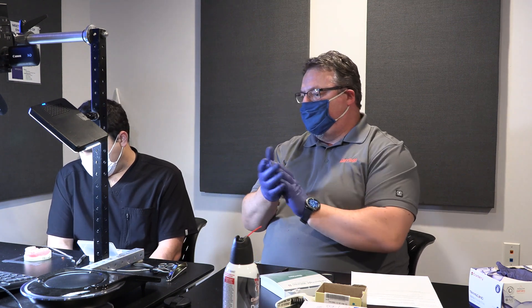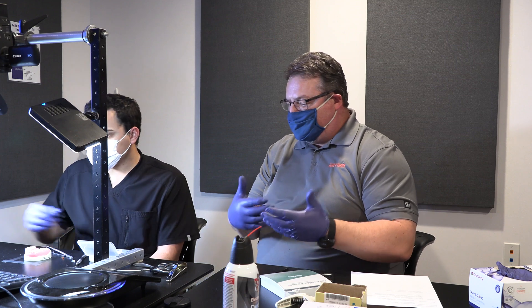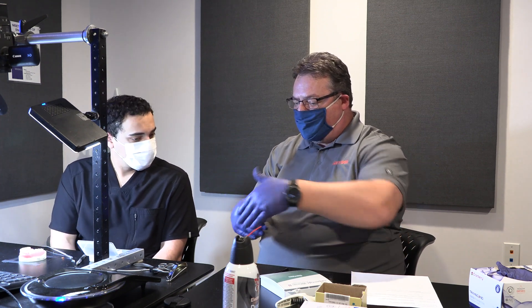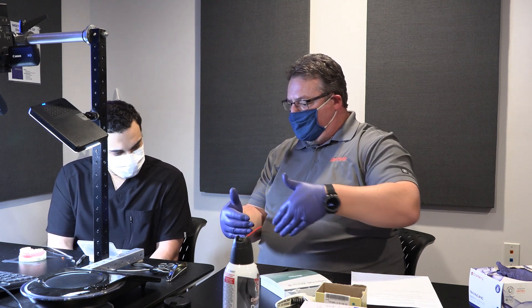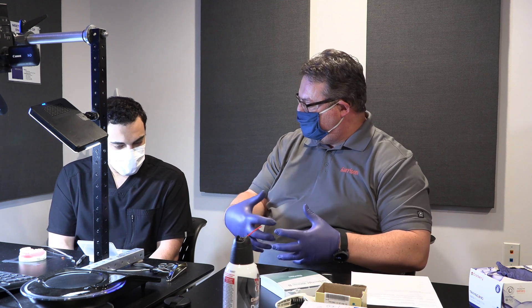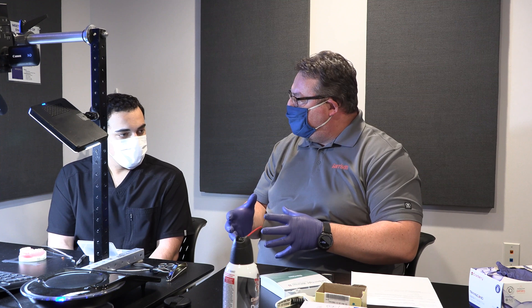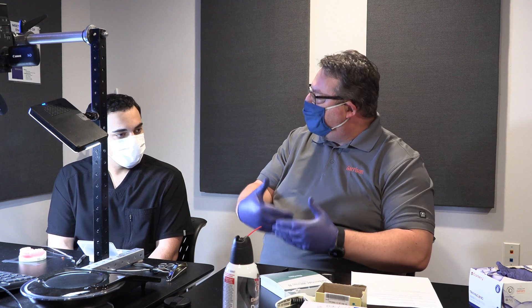Dr. Corey, one of the questions that a customer has posed for us is: on an anterior, let's say tooth 8 or 9, and maybe a Class 4, where the front of it has been beveled significantly to help blend that composite in place — what might be a good technique? Where would you put the band, and how do you make sure that you get the bevel filled all the way?